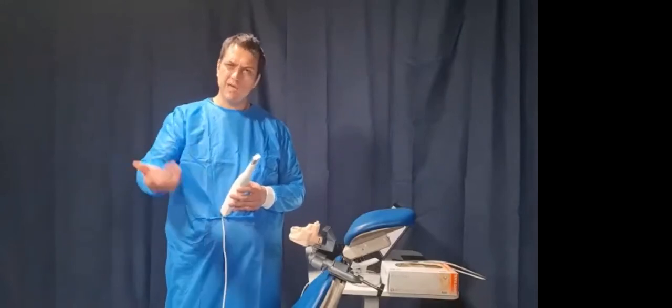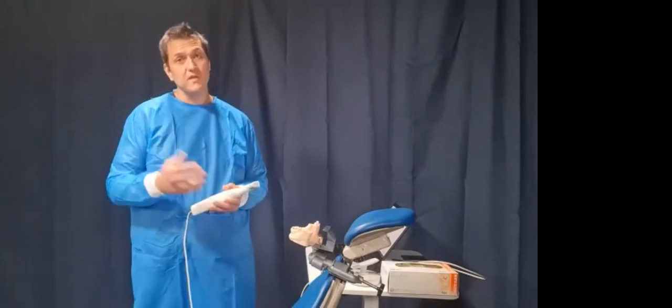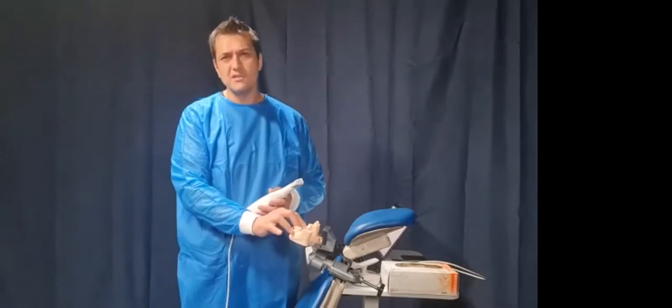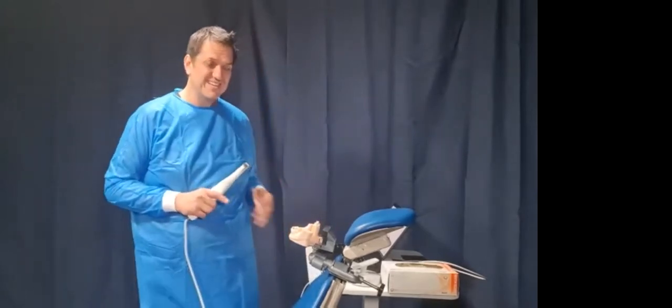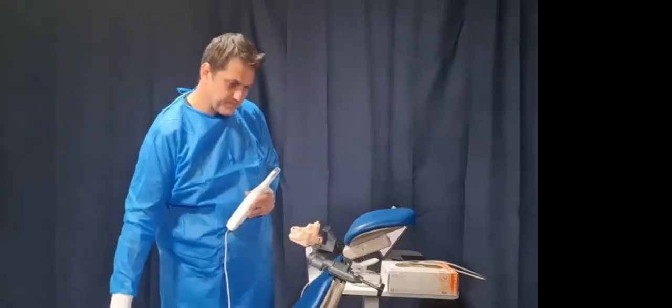Rolling around, and sometimes you need to get a wet tissue or some air, cotton to dry things off. But when you do that, you will find that you can actually capture an image. And again, this is a good case. Granted, both of these cases were quite good. Actually, the second one was a bit more tricky. As you'll find out, it's even tricky on the mannequins, which you'll see in a moment as well. Okay, so let's pop the head on top of this patient.